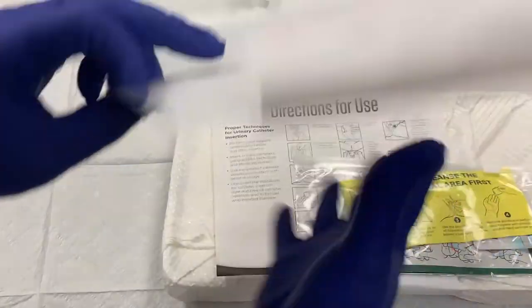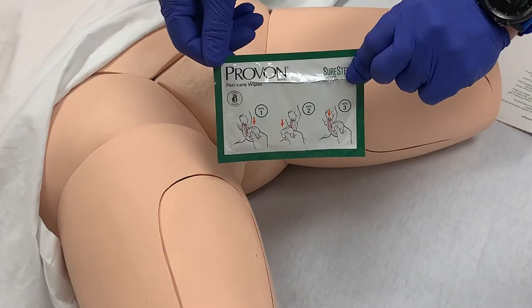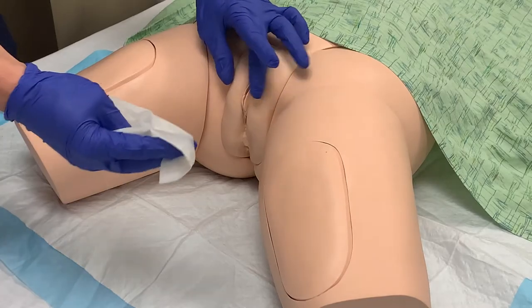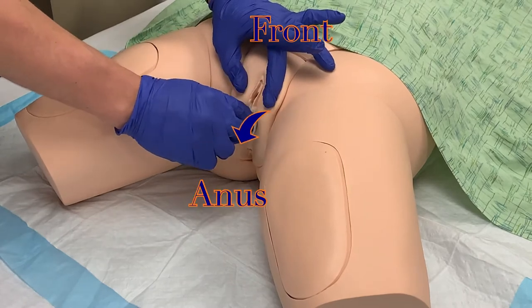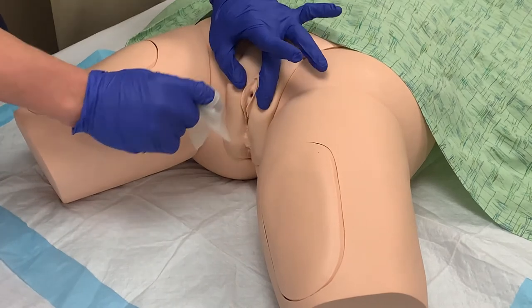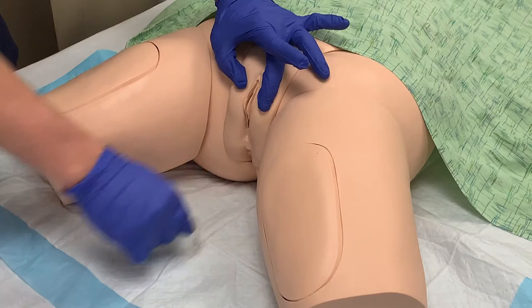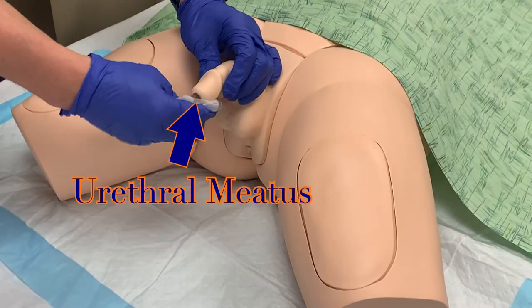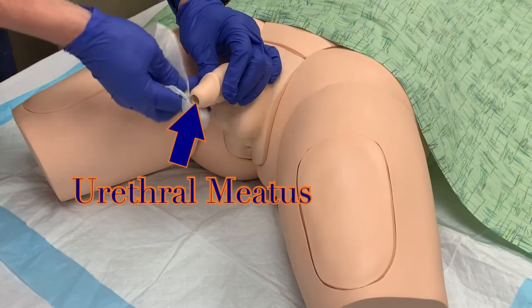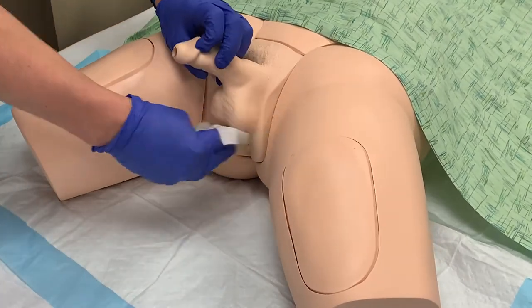After removing the cover, the first item you see is a Ziploc bag that says: Stop. Cleanse the periurethral area first. Before advancing any further, take the time now to perform peri-care on the patient with wipes provided in the bag. For women, cleanse the far labia with one wipe, wiping from front to back, then the near labia in the same fashion with a separate wipe, and then use the third wipe to cleanse between the labia, always wiping from front to back with a single wipe before discarding that wipe. For men, begin at the urethral meatus at the tip of the penis, wipe in a circular motion advancing toward the scrotum, using all three wipes and cleaning about a third of the area with each wipe.